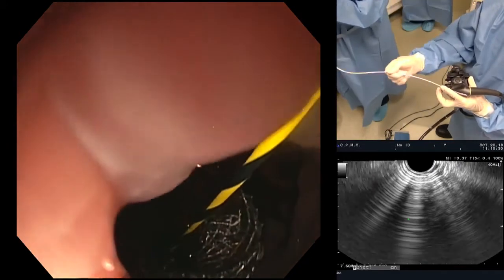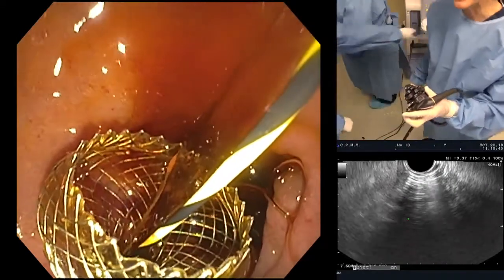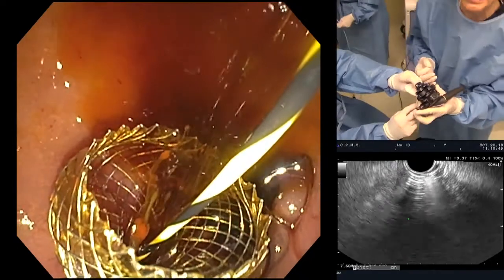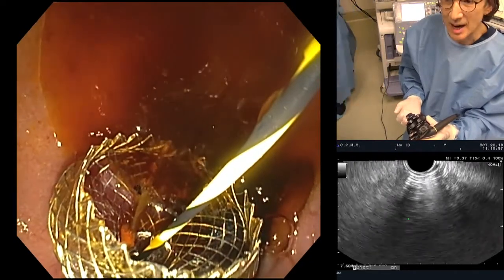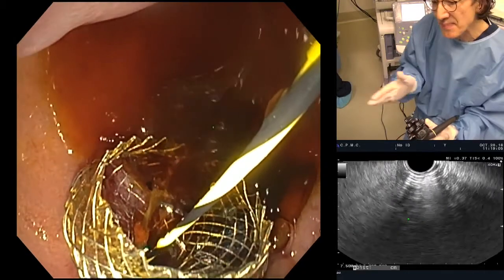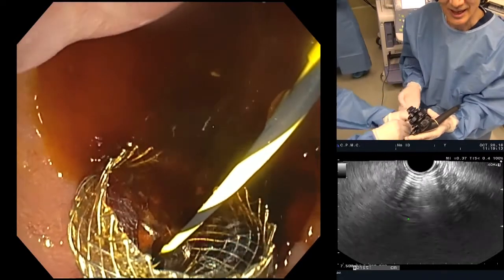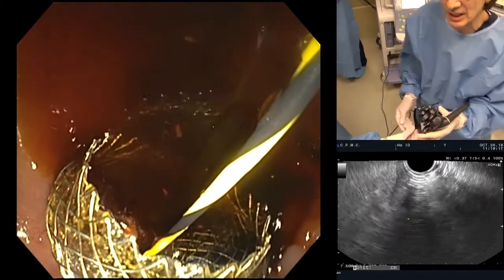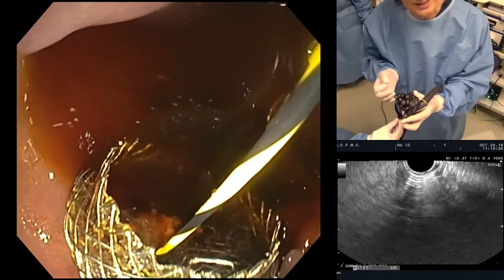So sometimes you balk at the cost of these things, but you have to also understand what goes into a device like this to make it actually in the end so easy for us to use, so reproducible, and it's a one-time use device. So just think about that, right? It has to be robust enough to withstand all sorts of unexpected circumstances, and yet that cost can't be too excessive because it is a one-time use device. So it's a fine balance to create a product in a one-time use culture. And that's what we live in here in the United States, regrettably, because I think it's carried to an extreme that is so wasteful. But that's another topic. And so it's a real challenge.